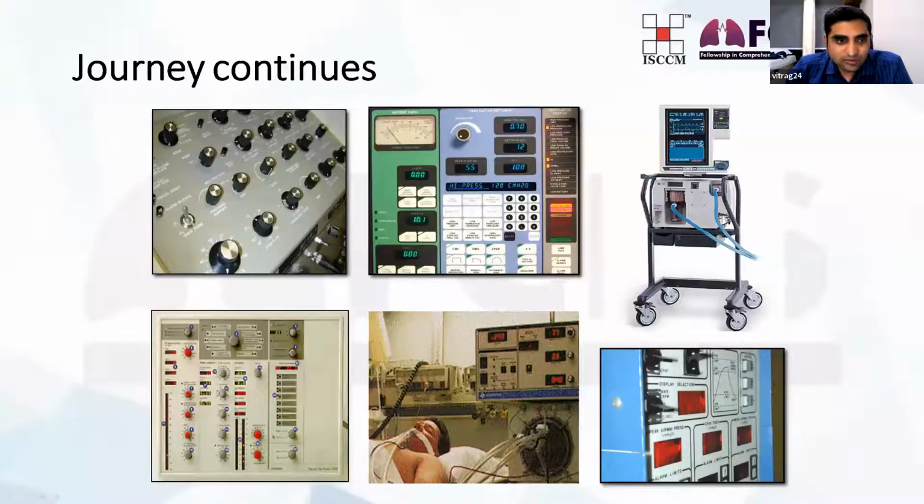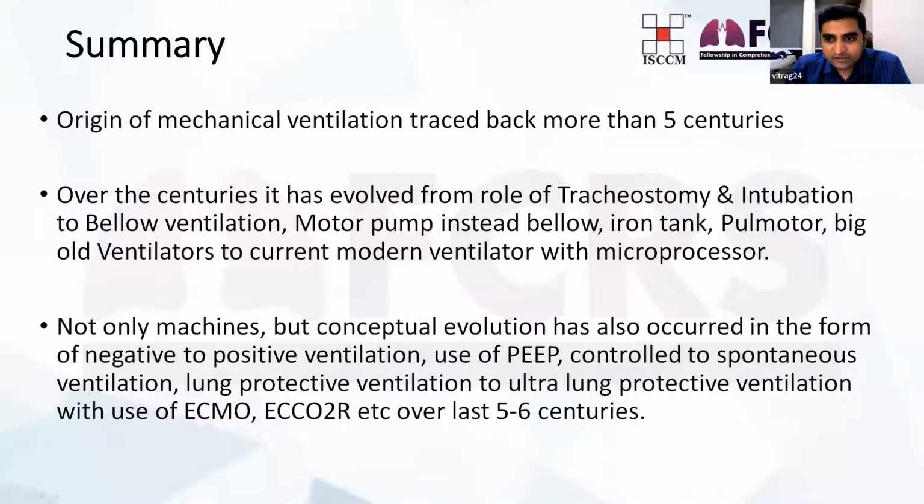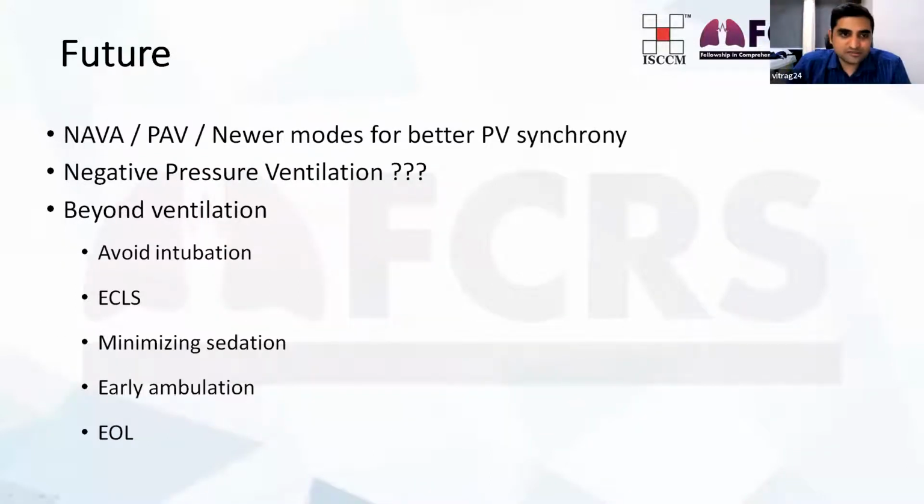So I would just request Sumit sir to summarize this history and evolution of ventilator, and then we can move ahead to the next presentation. Just in future, what we can see is not only newer ventilators or newer modes, but we can see evolution of negative pressure ventilators as well, or we can see beyond ventilator principles to avoid intubation, early ambulation, minimizing sedation, more end of life care, and extracorporeal life support. So over to you, Sumit sir.